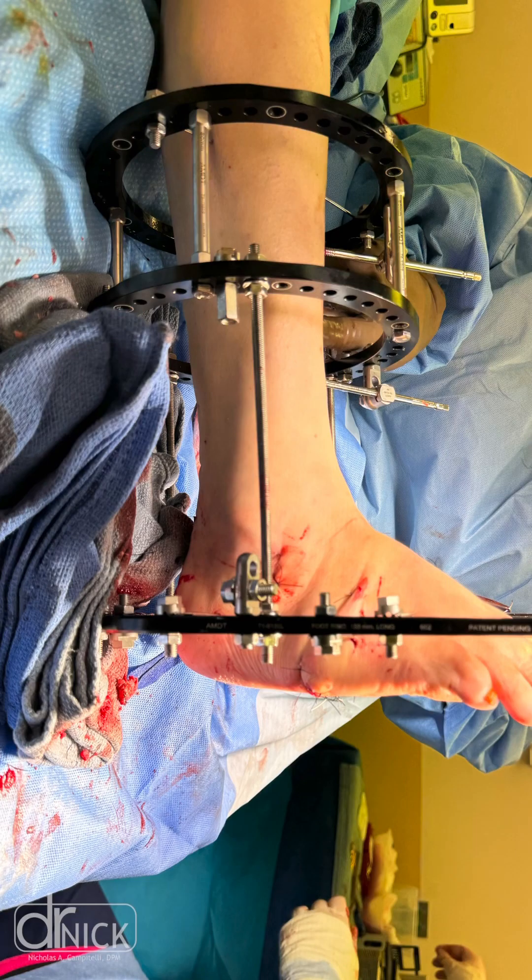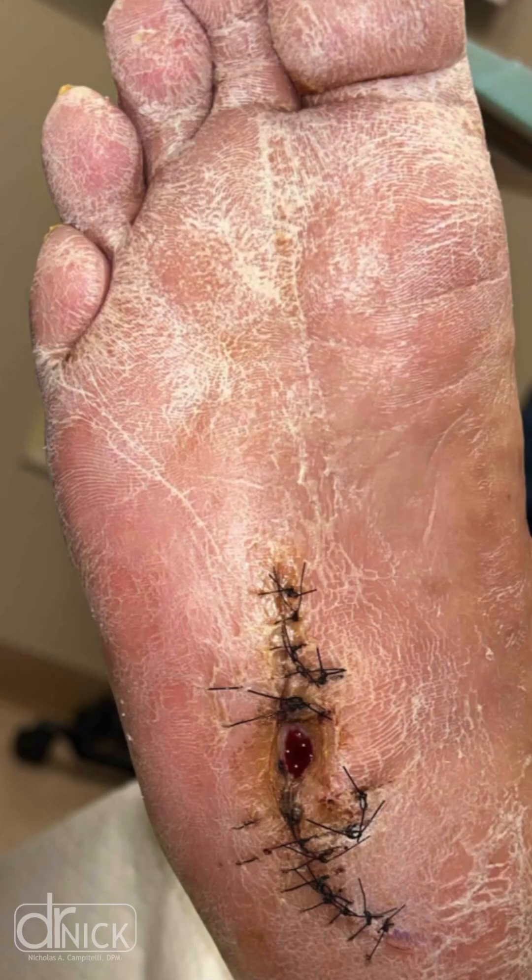Charcot foot deformity can be a severe, debilitating process. We were able to take this Arthrex external fixation system and reconstruct this patient's foot to take away a bad ulceration that they were having on the bottom of their foot.